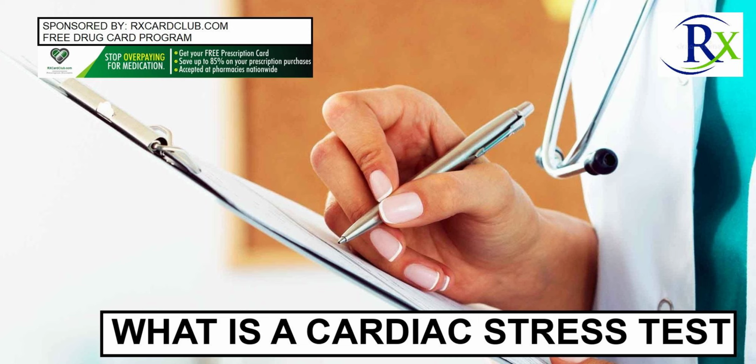Test limitations. Stress tests have both false negatives, where the test is normal despite having significant blockage, and false positives, where the test is positive when coronary arteries don't have significant blockages.